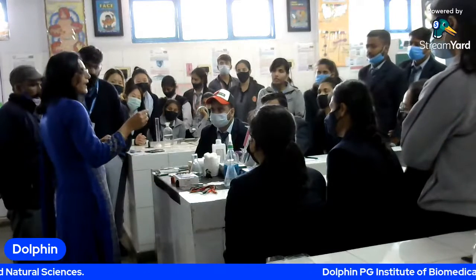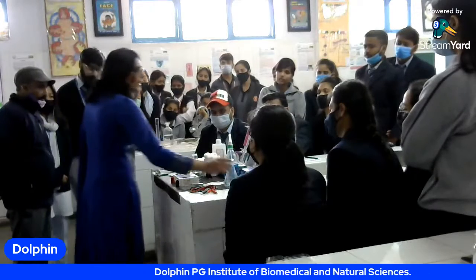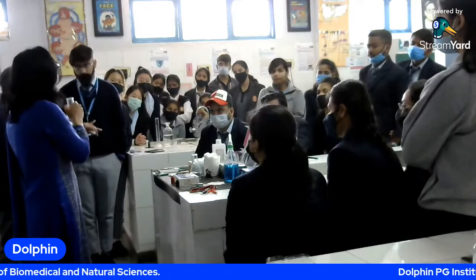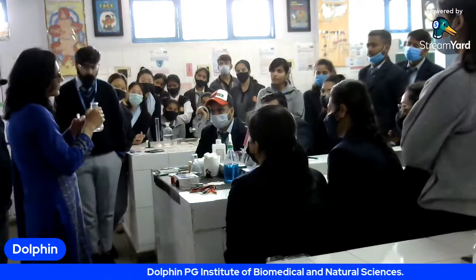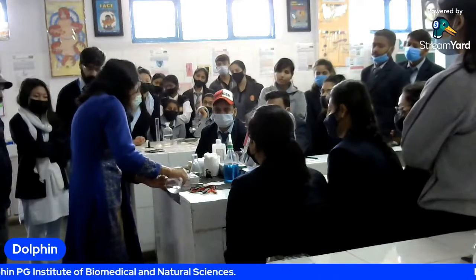You will add the anti-serum into the gel. This gel is the agarose gel. Now that its temperature is tolerable, as I am feeling it, it is neither too hot, neither too cold. So we will add the amount of the anti-serum to this gel, and then this gel is poured off.